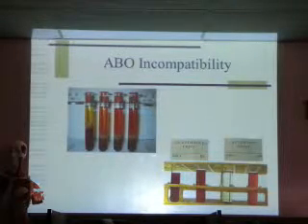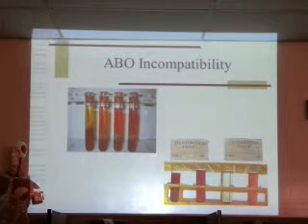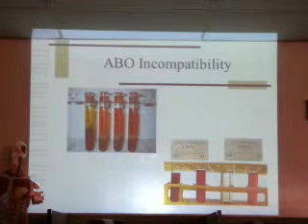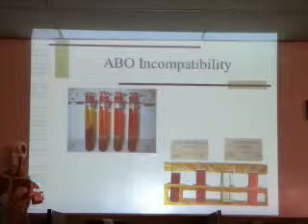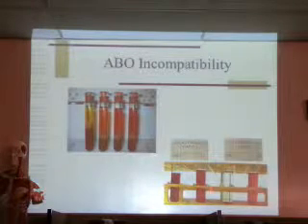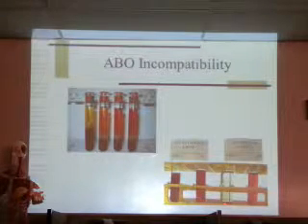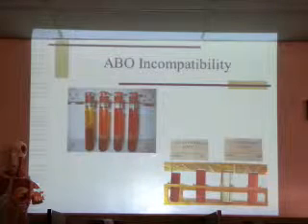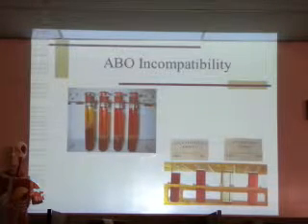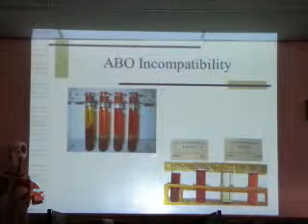In cases where we suspect a transfusion reaction, we'll collect urine and we'll spin it down. Because there is a difference between hematuria from, let's say, a urinary tract infection versus a true hemolysis. So here's uncentrifuged urine, and we centrifuged it, and the first centrifuge tube has intact red cells that centrifuge to the bottom. Whereas in this one, which contains hemolysis, you spin it down and it's still red. It's because all those red cells have ruptured in vivo.